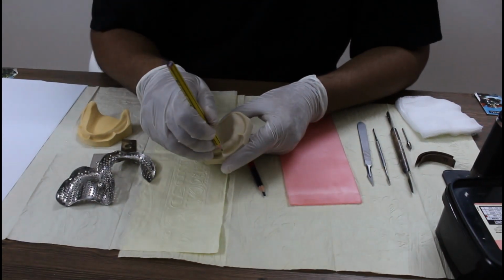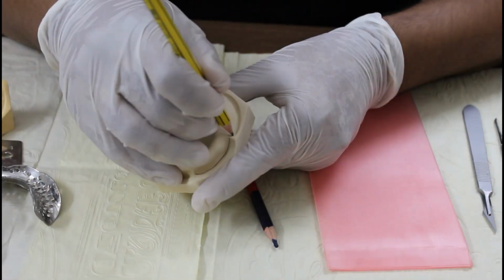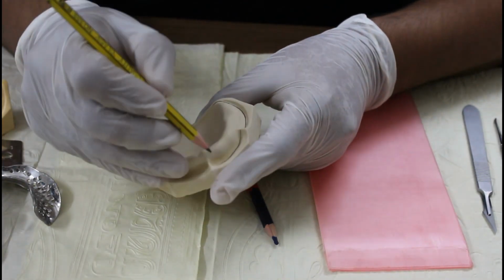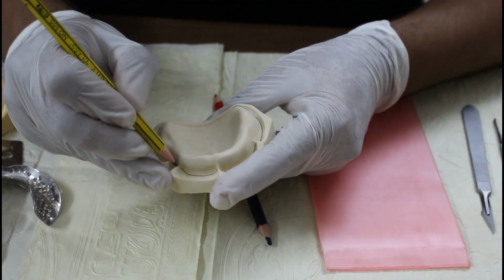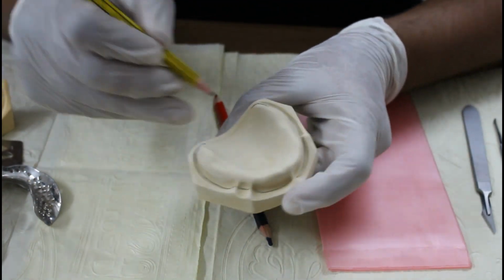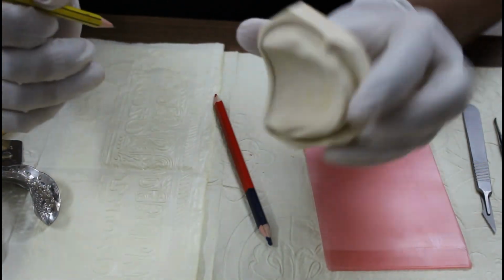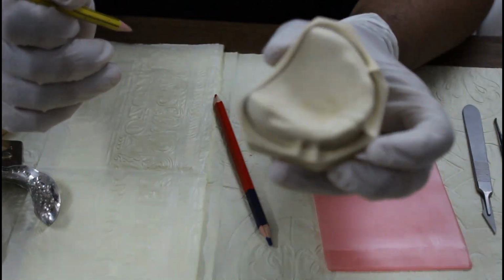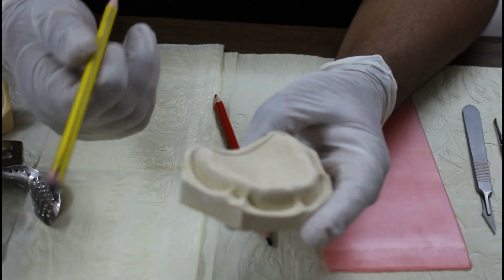So take your pencil and mark all the limiting structures on this cast. We have the labial frenum, labial vestibule, buccal frenum, buccal vestibule, hamular notch, posterior palatal seal area. You have to mark it with black color or normal pencil.